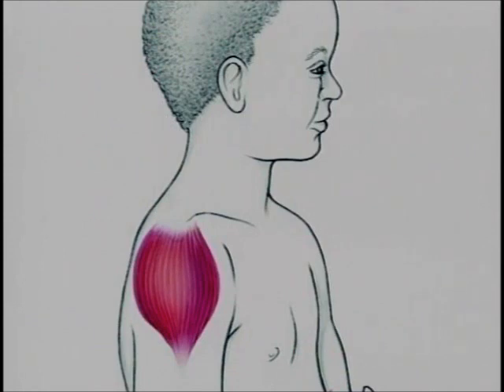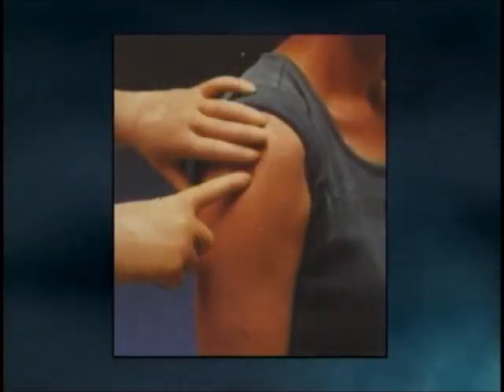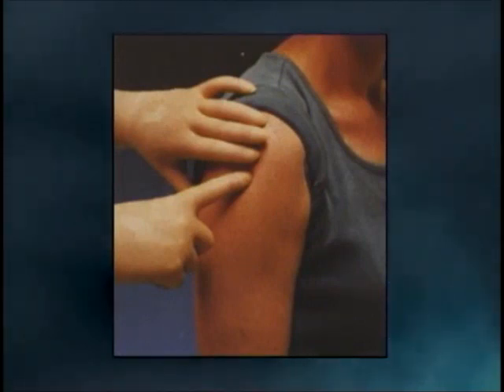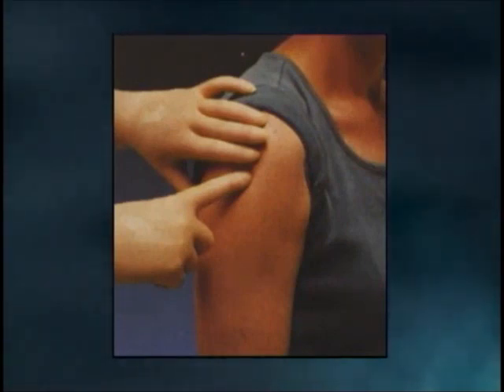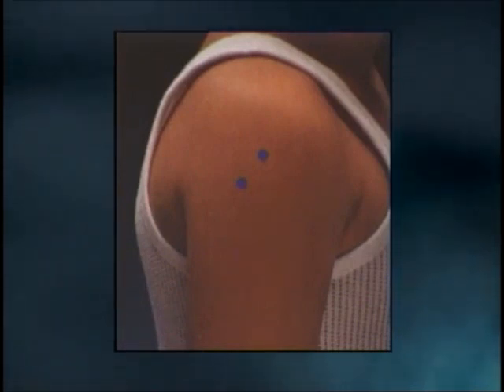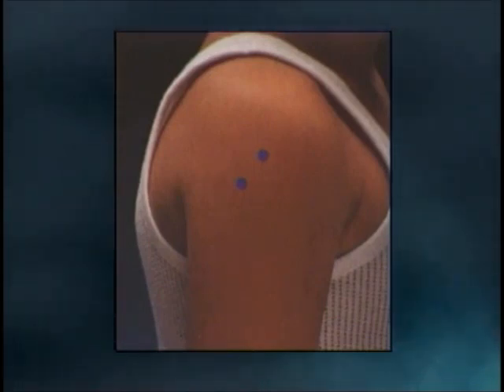For adults and school-age children, the deltoid is the preferred site for intramuscular vaccines. It is located approximately 3 fingers below the acromion, above the level of the armpit. Again, each patient is different, so we need to evaluate where the muscle is and where the needle should enter. Each deltoid can accommodate 2 IM injections. The deltoid also may be used in preschoolers if their deltoid muscle is well developed.